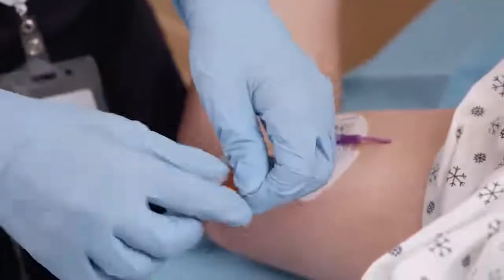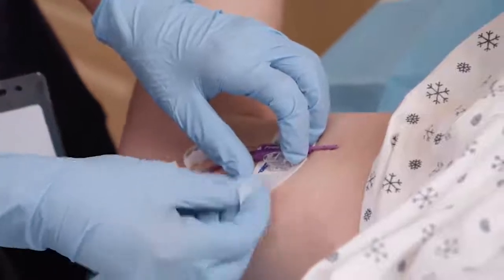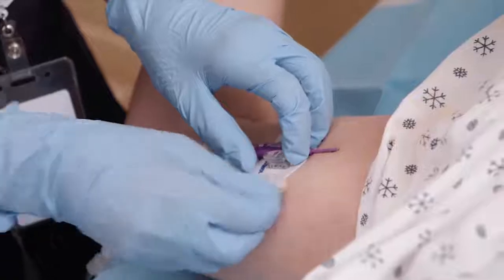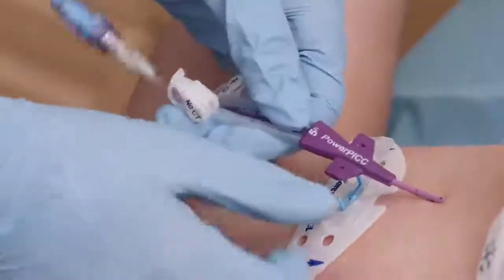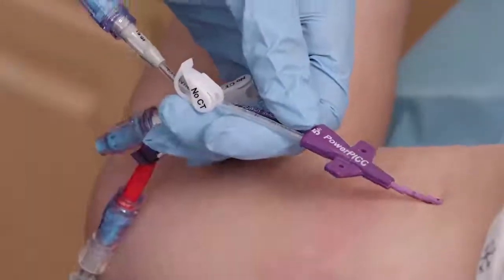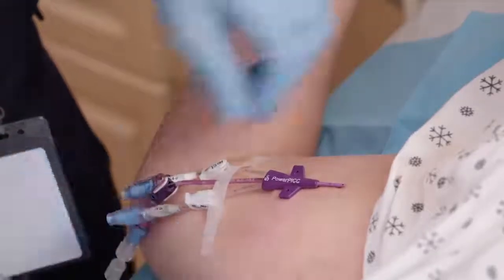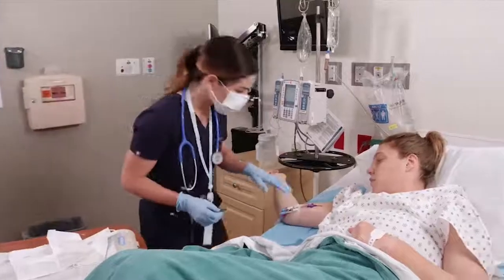Next, remove the stabilization device. Alcohol can be used to release the adhesive for easier removal. Unsnap the stabilization device from the catheter, assuring that the catheter is held in place during stabilization device removal. If the patient cannot fully cooperate for the procedure, the catheter can be secured with a small piece of tape or a steri-strip over the extension set tubing.